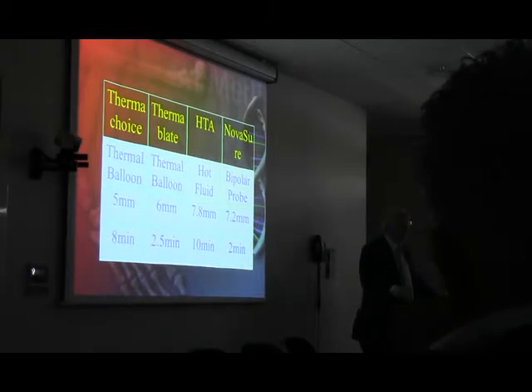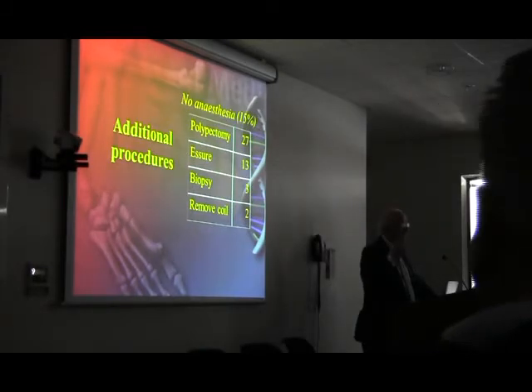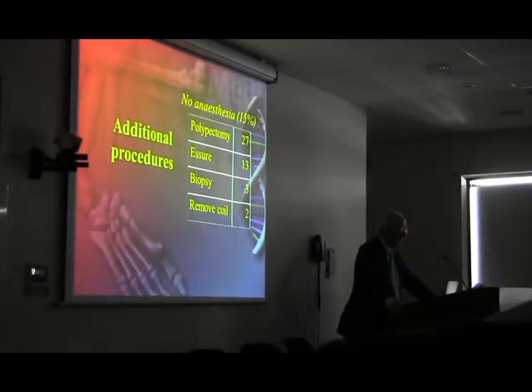And there are several devices out there. There's the one that the Indian guys make in San Francisco that's smaller, isn't it? But I don't know if that's been widely used yet. But they're coming up. And for the moment, I think we're looking at NovaSure thermal ablation really as fulfilling the criteria for outpatient acceptability.